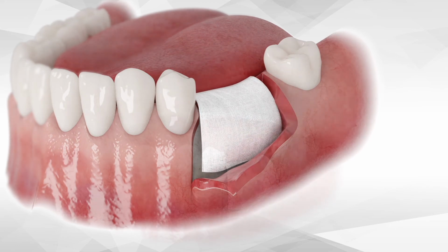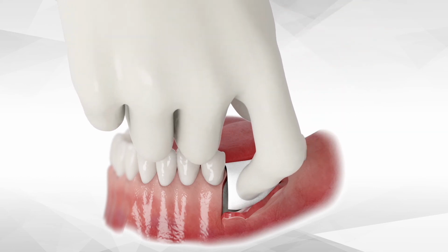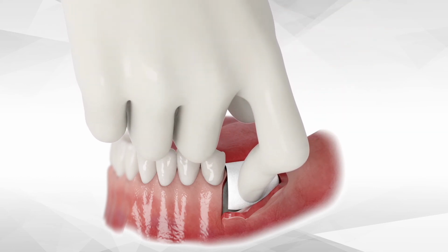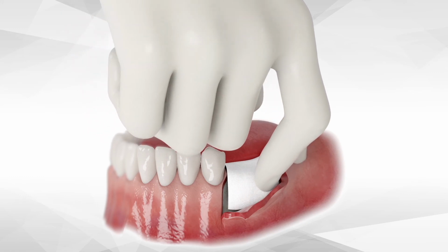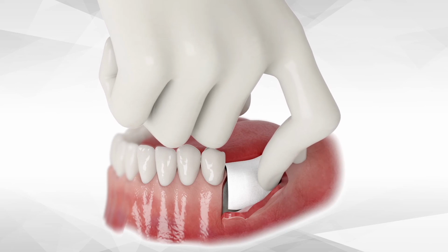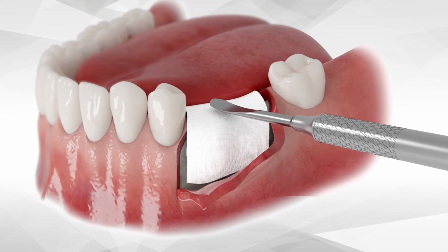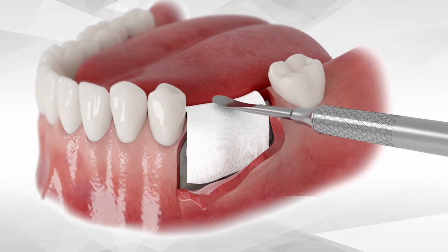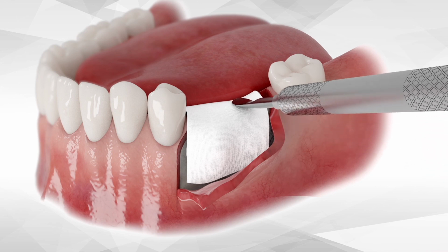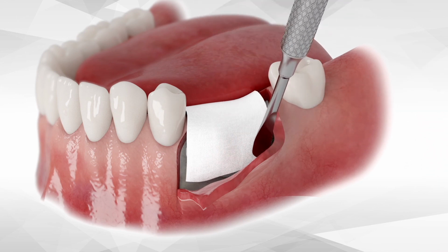Immediately, a sterile unfolded dry gauze is placed over the cement and pressed firmly with the finger from the buccal and the crestal direction for about 3 seconds. It's extremely important that the Bond Apatite cement will be well compacted. Thus, after pressing with the finger, use the periosteal elevator in order to continue with the compaction of the graft for an additional few seconds, again from the buccal and crestal direction.